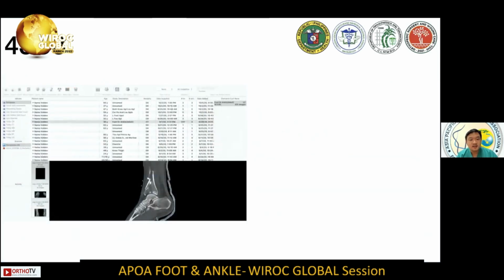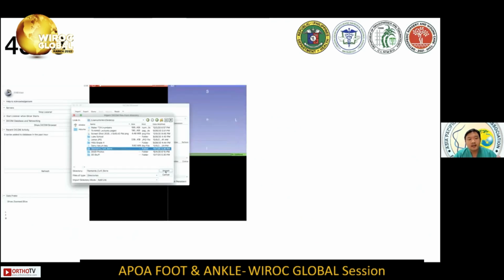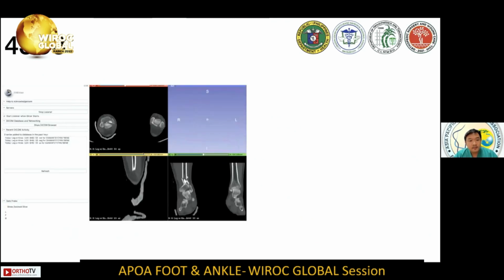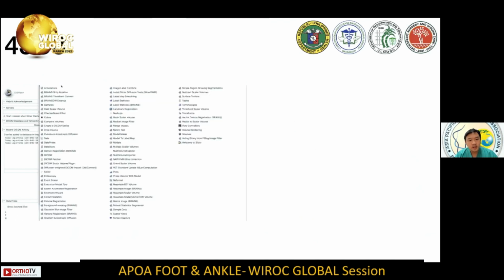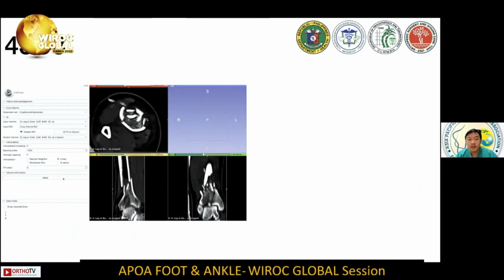So this is just the DICOM software. I am about to export it so that I can put it into a slicer app. So basically, we're looking now at the region of interest so that we can narrow down which part of the fracture we want to print out.